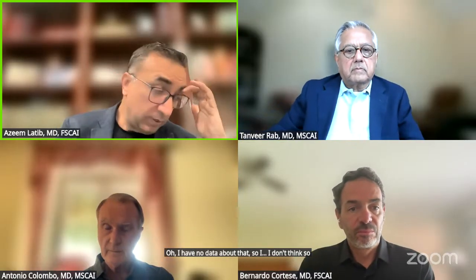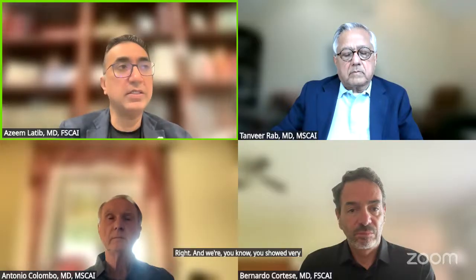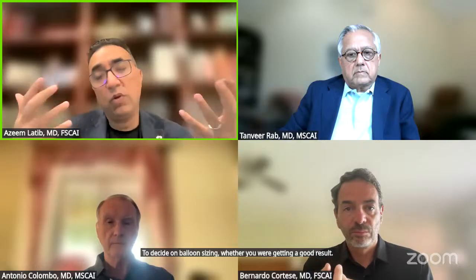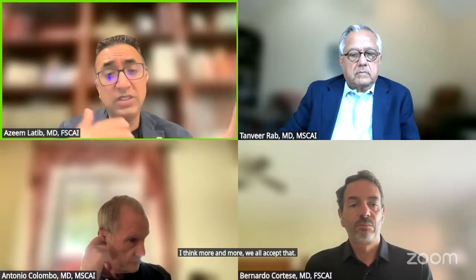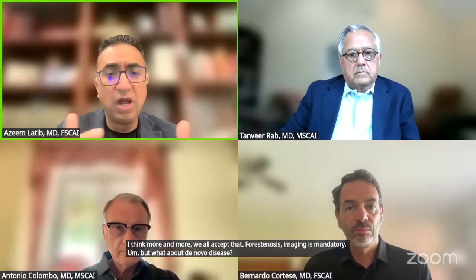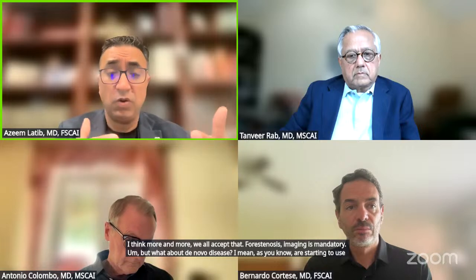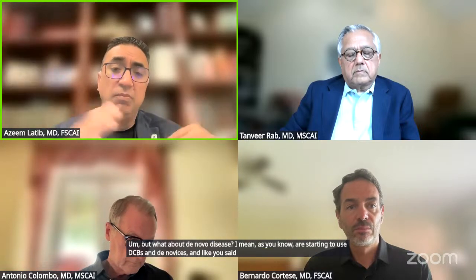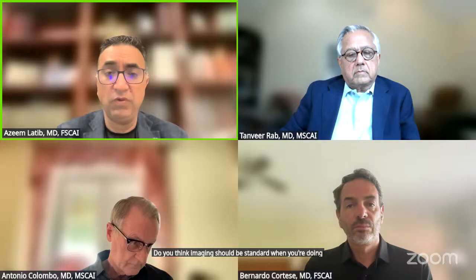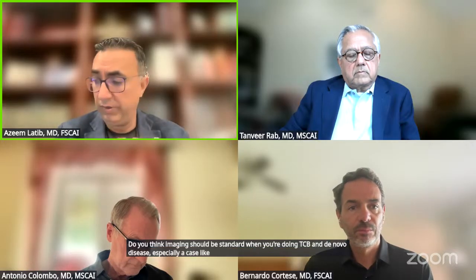You showed very nicely in your case how the imaging was very useful to decide on balloon sizing, whether you were getting a good result. I think more and more we all accept that for restenosis, imaging is mandatory. But what about de novo disease? As you are now starting to use DCBs in de novo disease, and like you said, in the US most of us are at the beginning of our learning curve, do you think imaging should be standard when you're doing DCB in de novo disease, especially a case like the one you showed? Oh, absolutely.